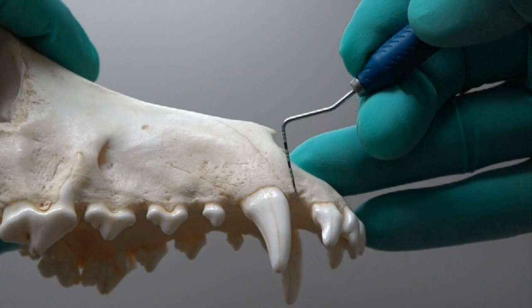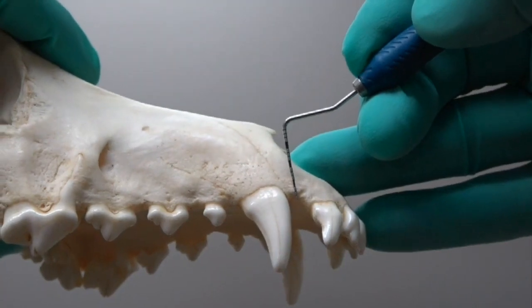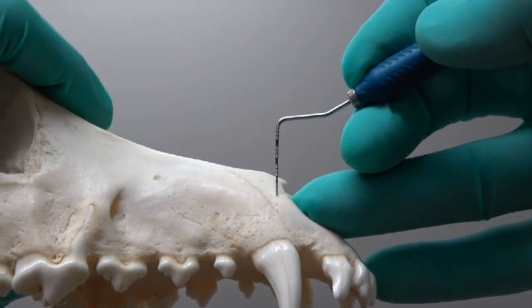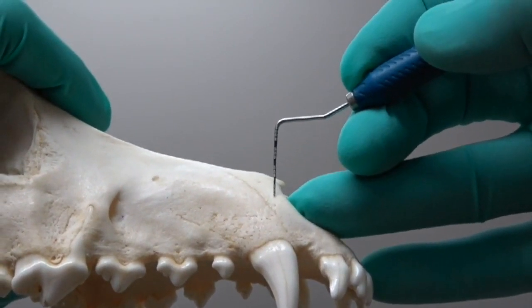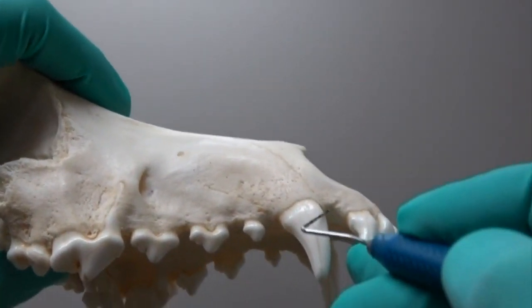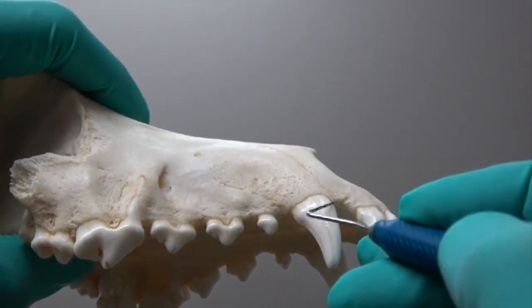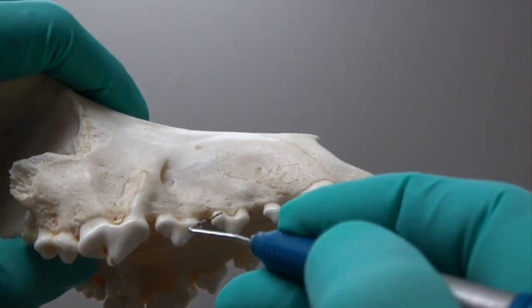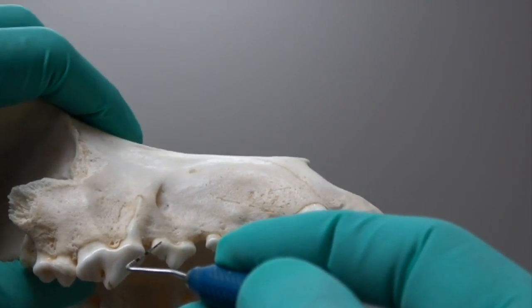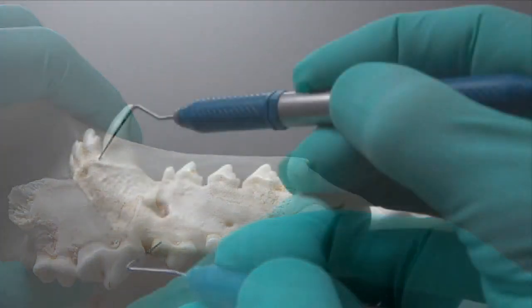For the maxillary canine tooth, we start in the diastema between the canine and the incisor, carry that up and parallel to the tooth to about the level of half the length of the root. Then for our envelope incision, start right back where you started the incision for the vertical release and go all the way back to the distal aspect of that third premolar. That's the same approach for the mandibular canine as well.